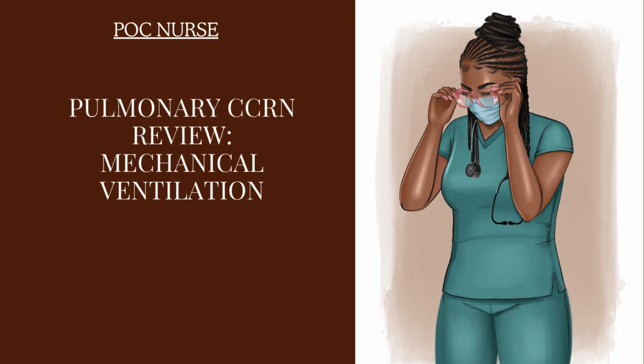Now the FiO2 is fraction of inspired oxygen. Like I said before, once the patient is intubated or immediately they're intubated, they usually start at an FiO2 of 100%, but this is later titrated down to the least amount of oxygen that the patient needs to maintain an acceptable O2 sat.